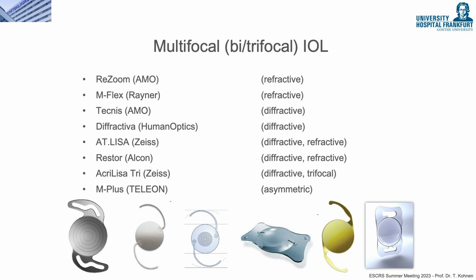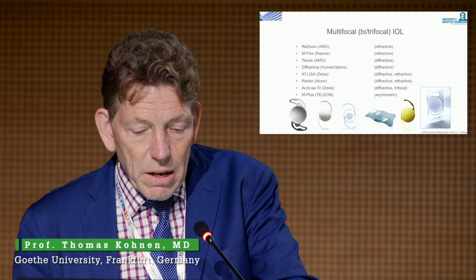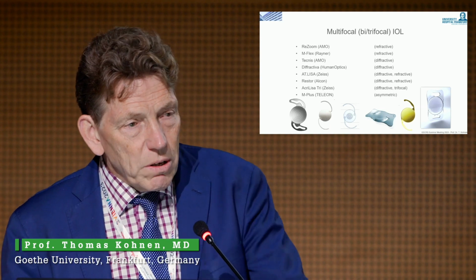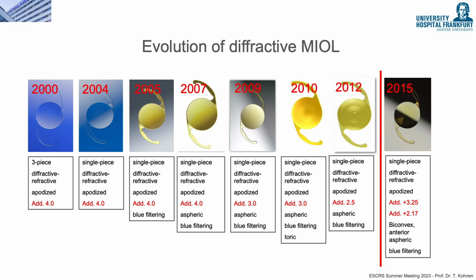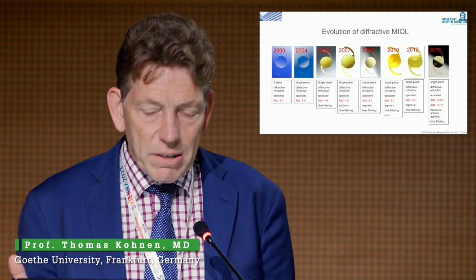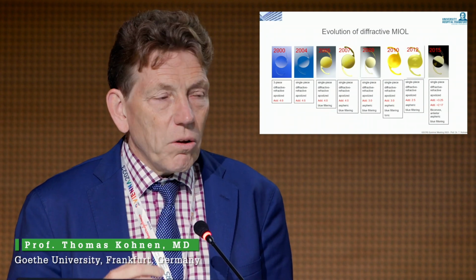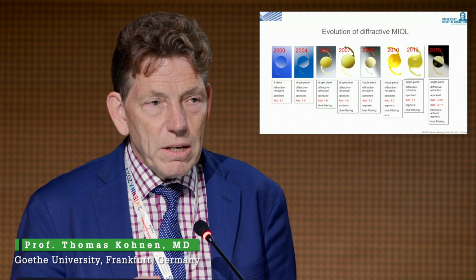Here are the multifocal lenses. I have been investigating lenses for now more than 30 years, starting with the diffractive trials with the 3M trial and then Rezoom, and you can see a lot of lenses which we put here on the evolution base. We also looked at a diffractive lens from 2000 to 2015, all iterations. It's interesting to see from one company, that's Alcon, what they have done to make sure that lenses, although the technology was a diffractive technology, have increased.